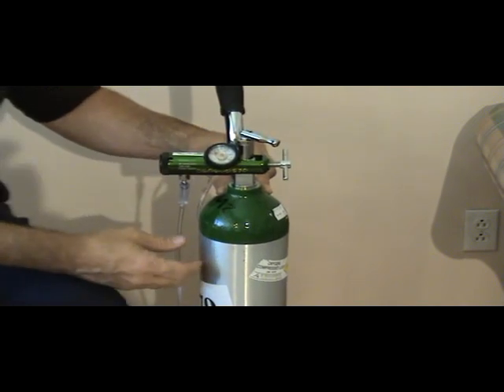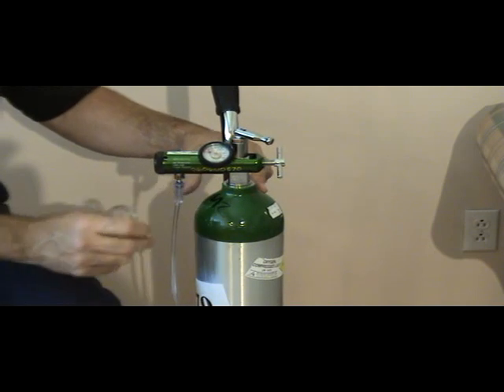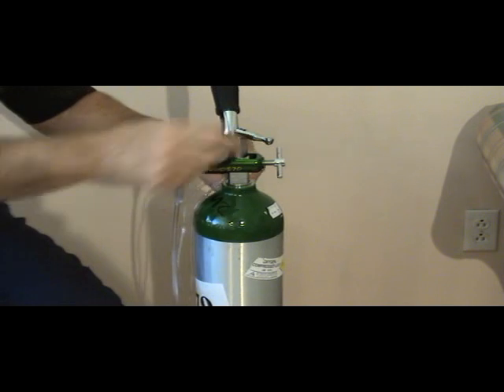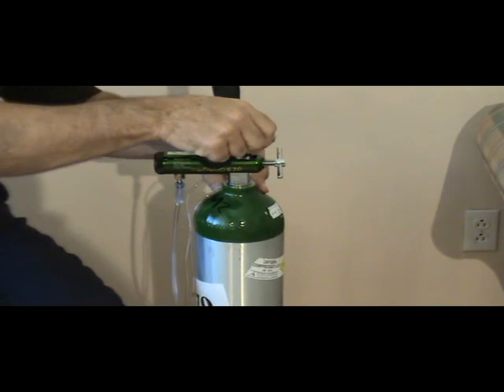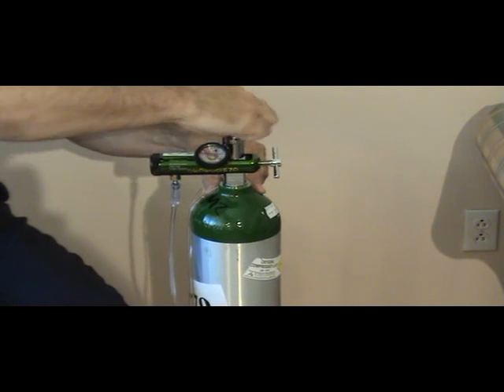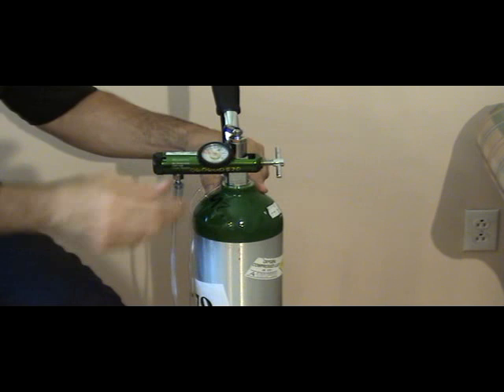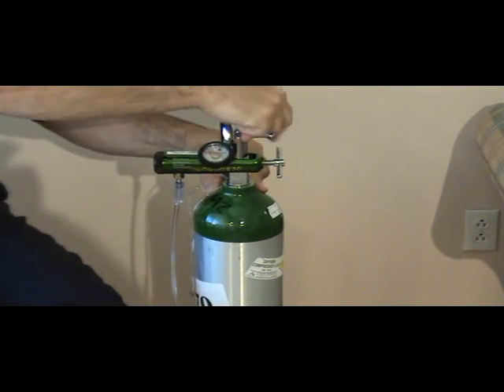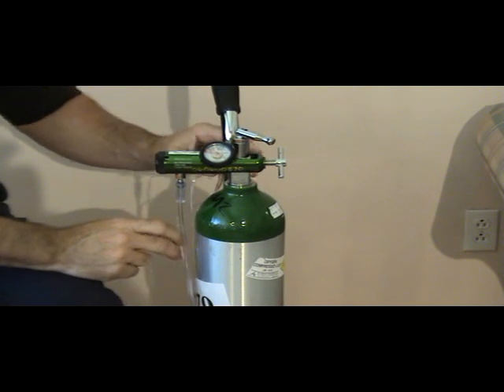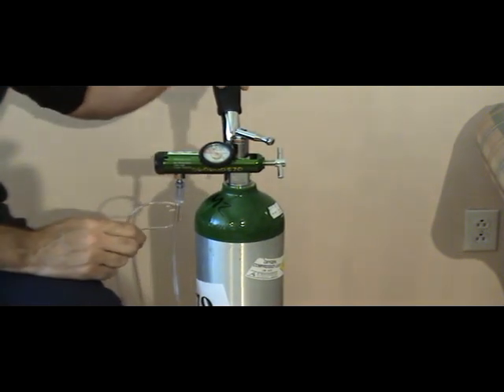This way, if you need to use this tank again, there's only 2 things you need to do. You have the nasal cannula already hooked up, so you attach that to the patient. You go up to the knob up here, or to the toggle switch, and turn it counterclockwise. Don't have to turn it very far. You're ready to go. That's it. Again, make sure when you're not using it, you turn it off. You do not use humidification for this. This is used for mobility of the patient or in case of a power outage.